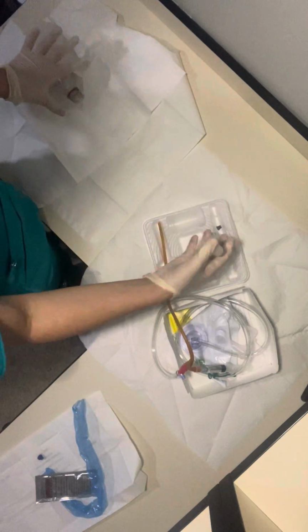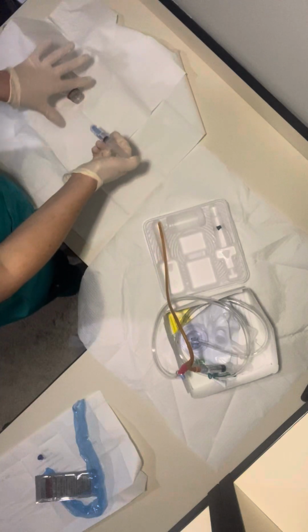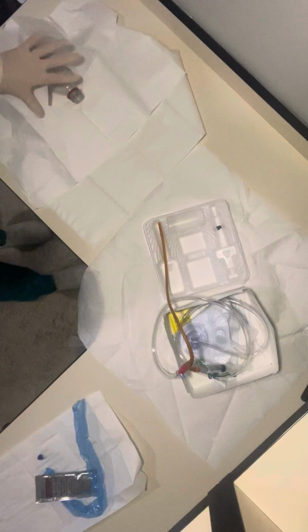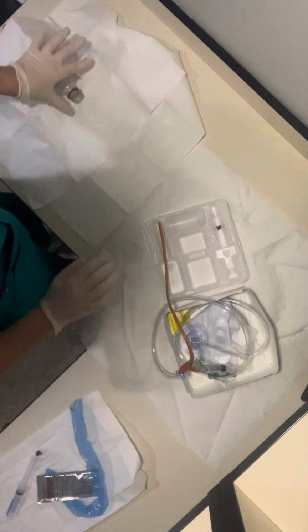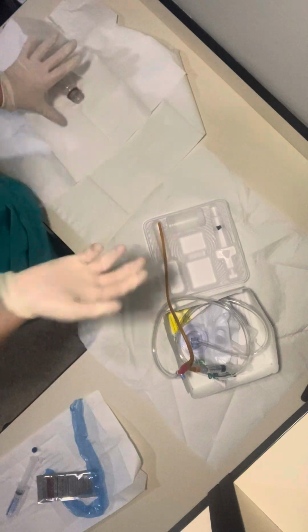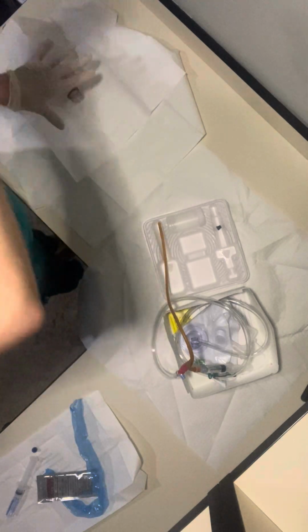Okay, and then at this time I would get ready to place the catheter, but I'm going to take some lubricant and place it in the area, just to provide some lubricant. And they say to wait 5 minutes or so. So for the sake of the video and time, we'll just say that we have waited.